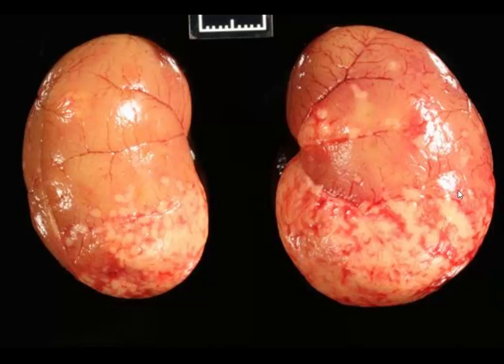And these white patches are generally largely composed of extruded fibrin and a mix of inflammatory cells, which is never the same. I always say that every case histologically looks a little different. Some are pyogranulomatous, some are lymphoplasmacytic, some are lymphohistiocytic. So I like the term varying combinations and concentrations of inflammatory cells when I look at these slides. So, great looking case of FIP.